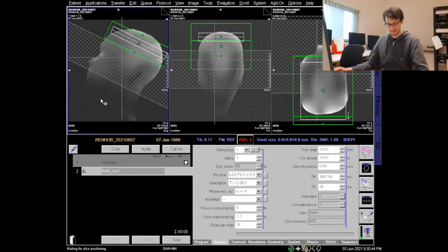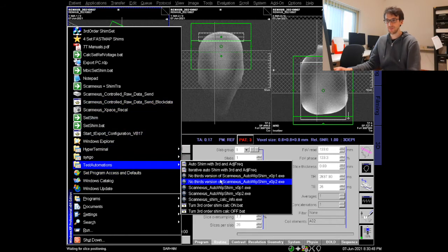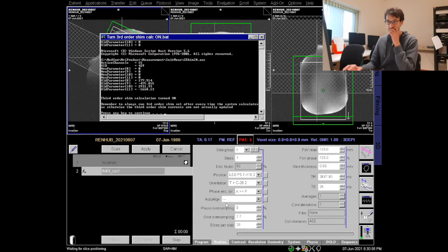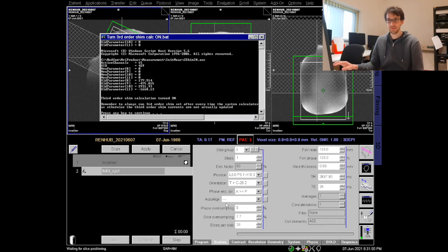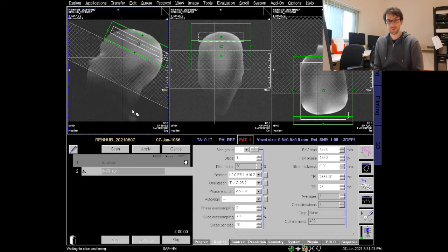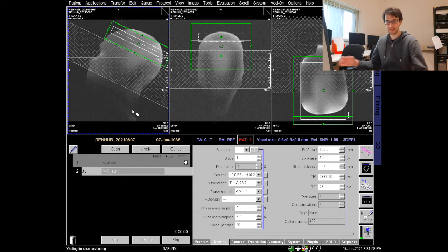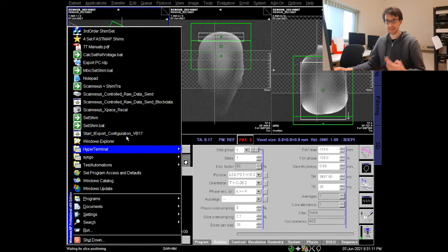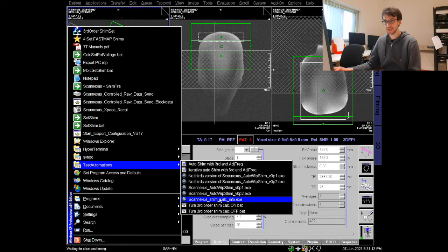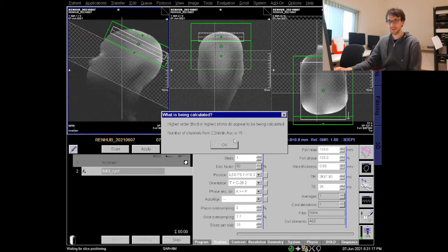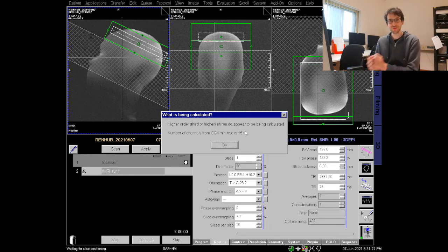Now I can switch them on again by going to the little windows XP menu by hitting ctrl and escape at the same time and now I'm not using the shim calc info but in fact I'm using the turn third order shim calc on.bat. I'm doing that, this executes this little script that Chris Wiggins provided and it asks me to press any key to continue so I'm pressing any key and now it should be switched on. If you really want to be sure you can again go back, hit ctrl escape, go to test automations and now again get the info. So now the number of channels is not zero anymore, it's now 15. So now we are ready to use the third order shim.